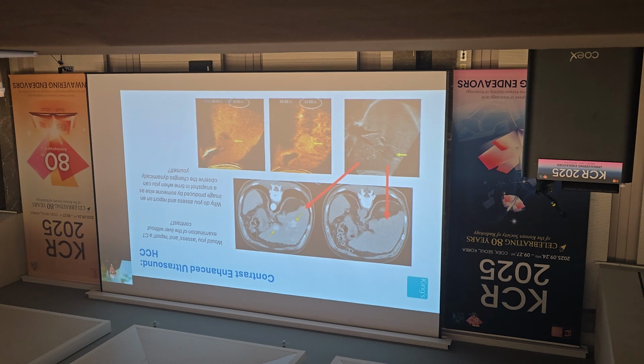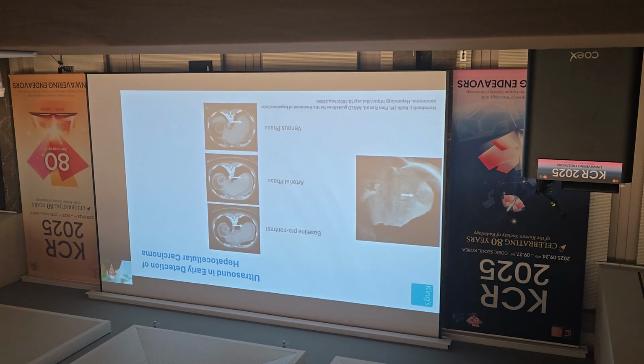And then adding the contrast, you can watch that lesion dynamically, and here we go from 13 seconds when it's hyperenhancement to 5.5 minutes, and it's washing out in this HCC. So you have washout in this HCC that you can wait for and get the diagnosis. So it must improve your diagnostic capabilities. And look at this one.